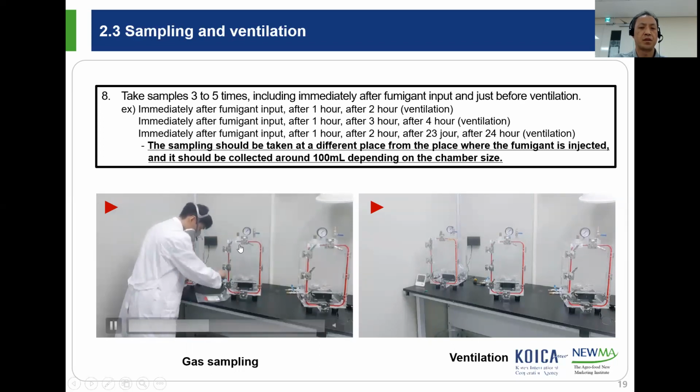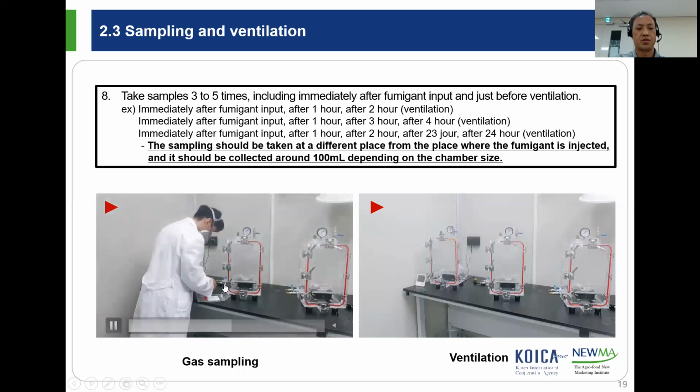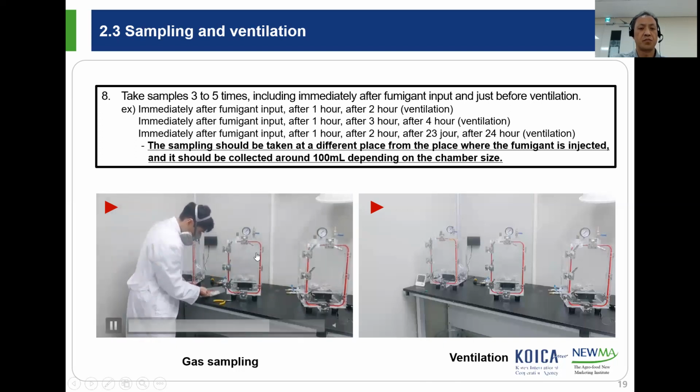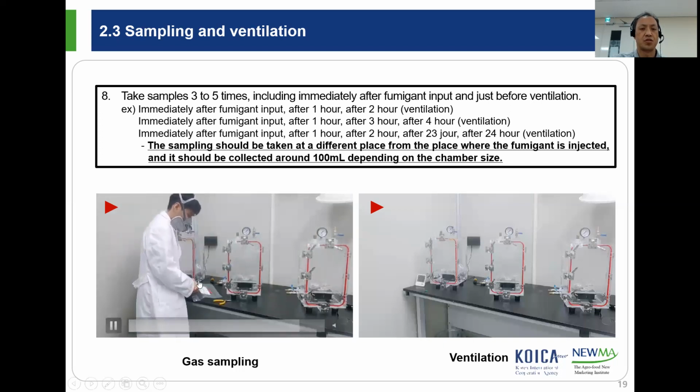The injection part is divided from the suction sampling part, like this. So you can take a sample by this part with a gas-tight syringe.